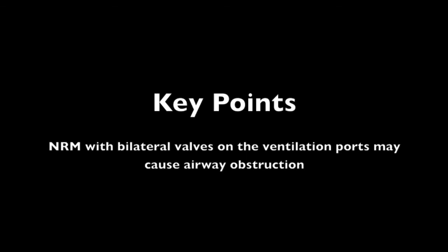Finally, non-rebreather masks with bilateral valves on the ventilation ports may cause obstruction and limit inspiration if exposed to conditions of sufficient hyperventilation in severely dyspneic patients.